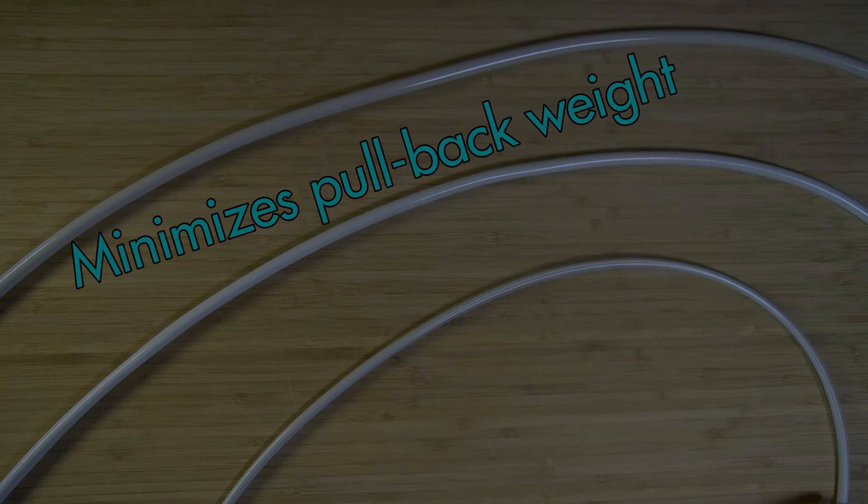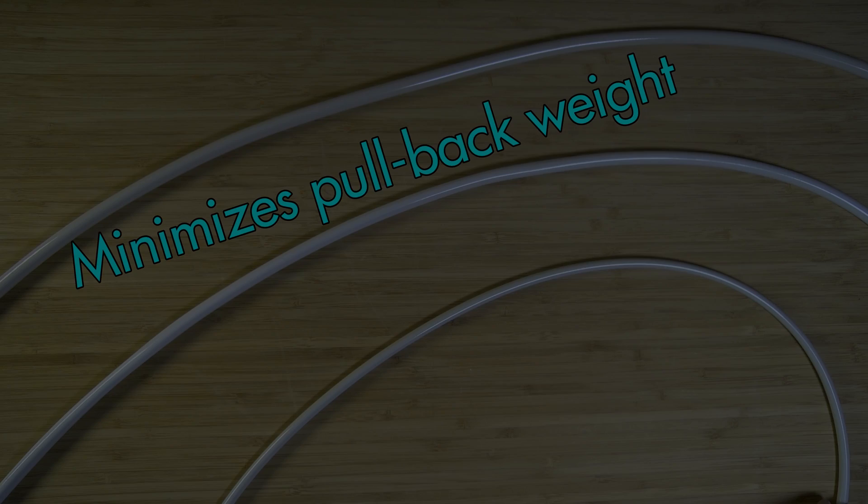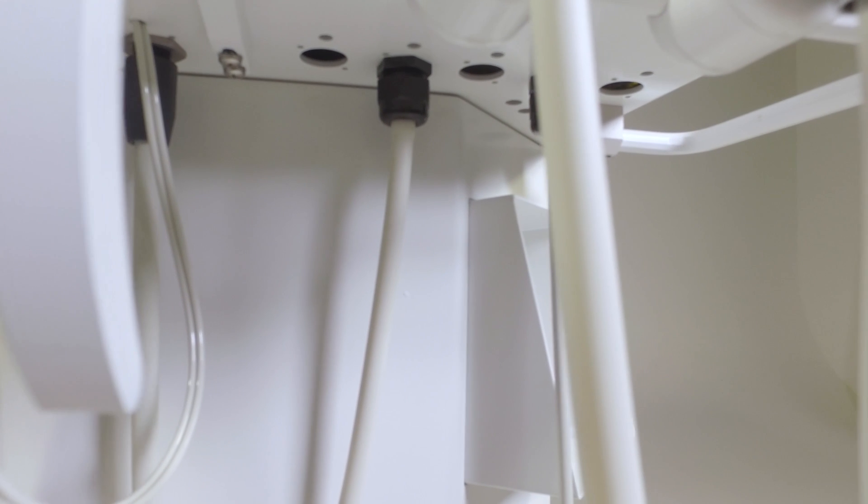The handpiece tubing is a smooth, lightweight design that minimizes pullback weight while in use. The tubing is modular and attaches to connectors under the cart to make ease of replacement if needed.